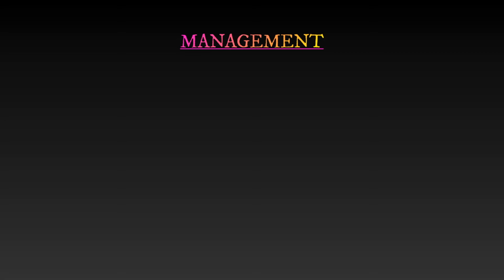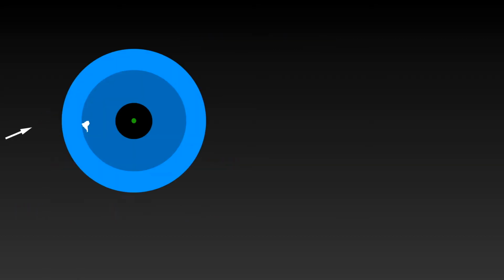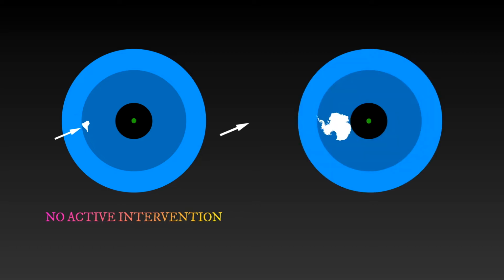in situ. Management would depend upon size and location of the retained tissue, clinical presentation, as well as experience of the operating surgeon. Small tissue tags which are peripheral in location are generally inconsequential and hence do not require any active intervention. However, if a substantial part of the lenticule is retained close to the visual axis, a surgical exploration should ideally be contemplated either in the same sitting or at a later date.